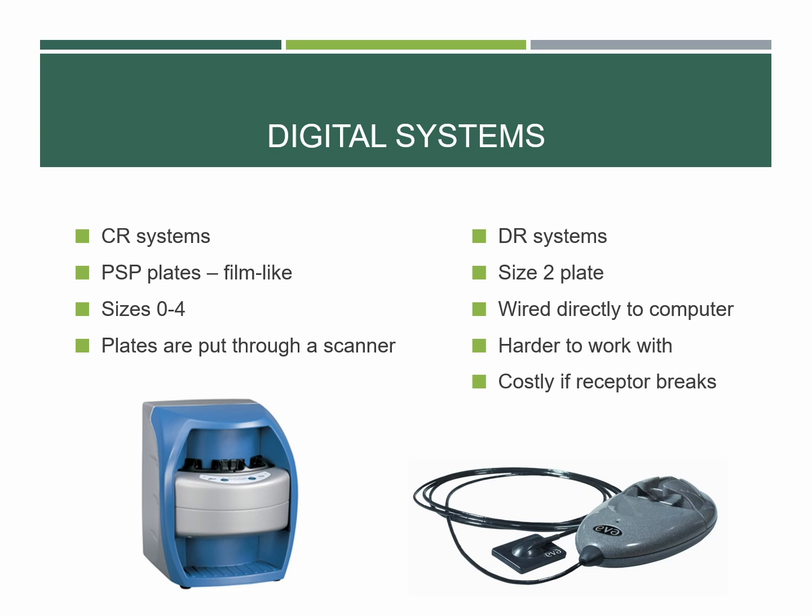We'll look at this in lab. To fit it through, you need to make sure that you put it through a guide so it doesn't get stuck, and there are different guides for each size. The other thing is you have to have the plate oriented blue to black, because if you put it in backwards, you're not really going to get a good image.